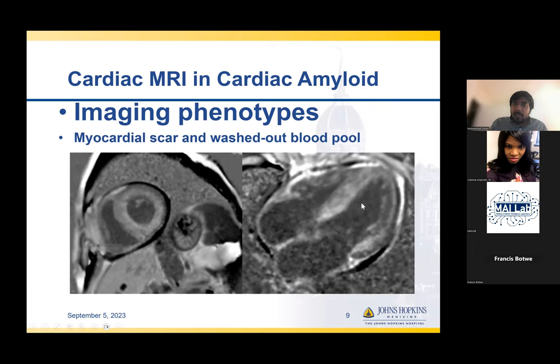You can see that the blood, where more gadolinium should be in post-contrast timeline, looks very dark. There are patchy areas of enhancement throughout the myocardium, more so on the subendocardial side. Now you can also appreciate some areas of intermediate gray to little enhancement patchy areas in a thickened RV wall. Besides that, it's hard to appreciate, but perhaps there might be some areas in the interatrial septum that are enhancing. There's a little bit of fluid in the pericardial space. So that small pericardial effusion also goes with the amyloidosis.